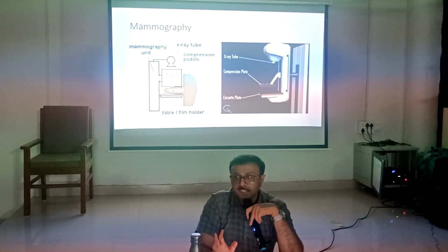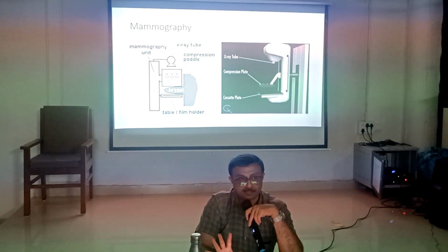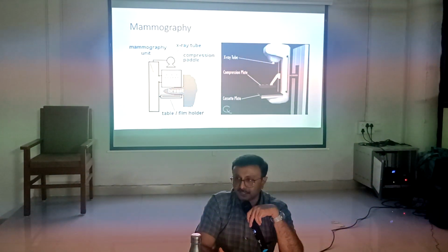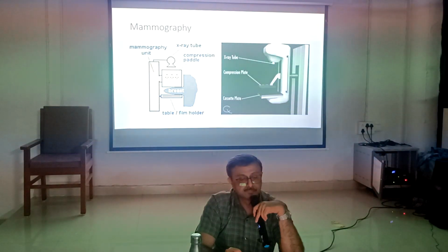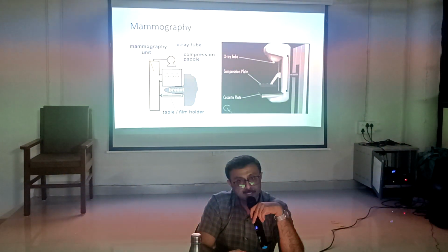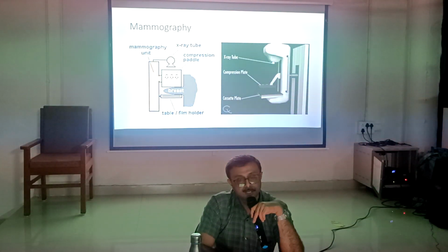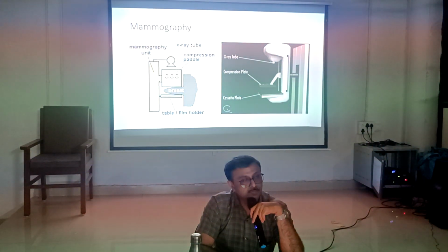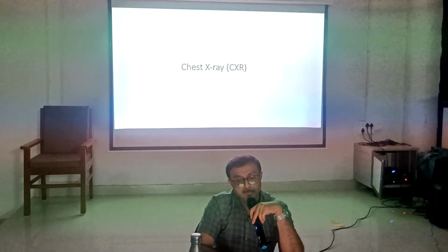How can it be done? It is not invasive, okay? It is a plain X-ray. Ductography is the invasive study. So there are two plates, the breast is placed between the two plates, and X-ray is done. It is very easy to perform, non-invasive, and very practical.